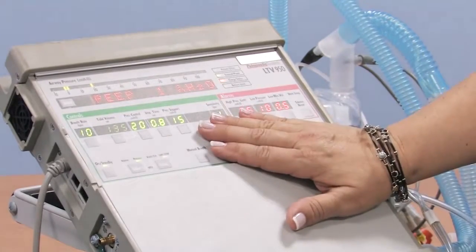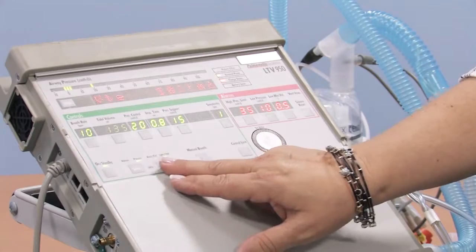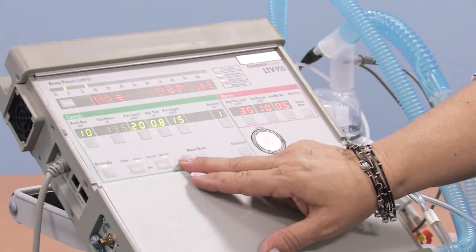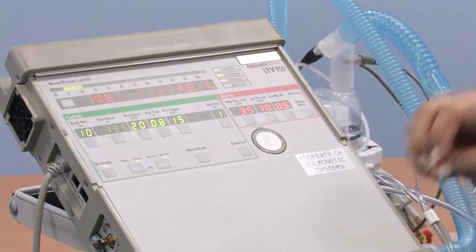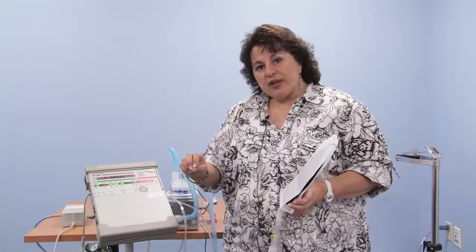In addition to that, we have the pressure support illuminated. So we're using the pressure control SIMV mode, meaning that we have synchronized intermittent breaths of 10. In 1 minute, on a breath rate of 10, typically a machine would fire every 6 seconds. But it's not going to do that, because what if your child's blowing out when it's time to breathe in for them? The machine is going to wait for your child to take a breath only for that 6-second window or so, and then if they don't take one, it will fire.